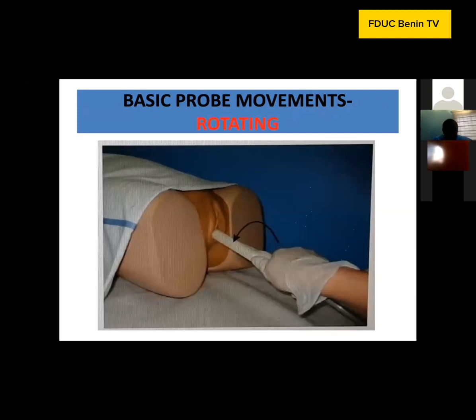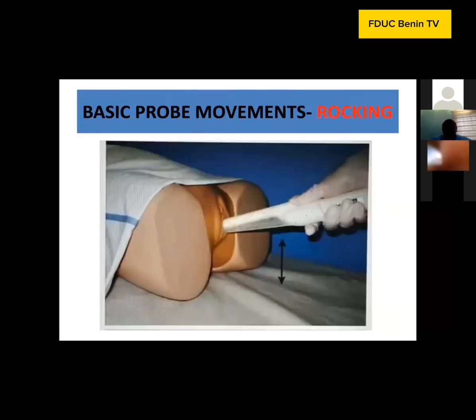All right, sorry, it appears I was lost. But I was talking about rotating movement. We have described that. And now we're talking about the rocking movement. And we said the rocking movement is traditionally with the probe facing 9 o'clock position, the transducer marker facing 9 o'clock position.